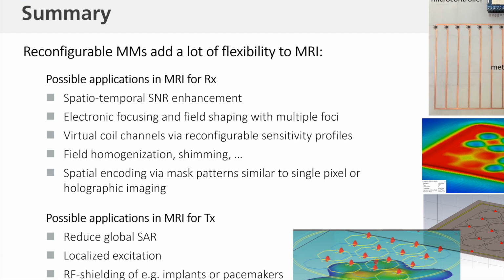That's why we are more looking into structures where we are creating a kind of light tower, where you are really shifting your focus continuously and using this information for spatial encoding.